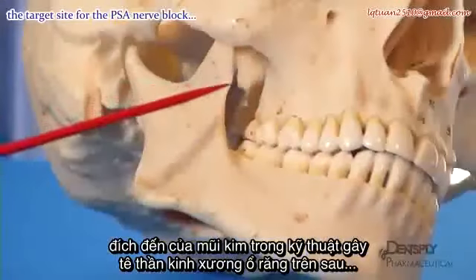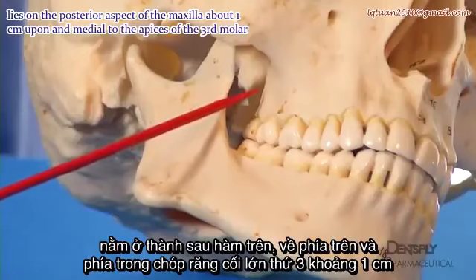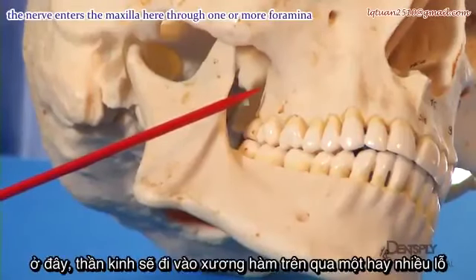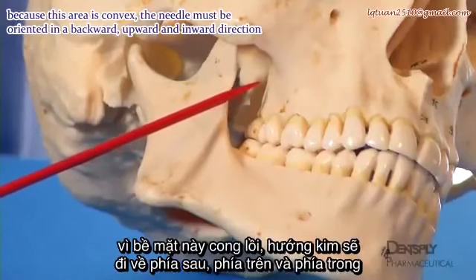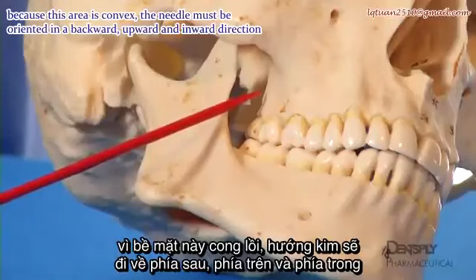The target site for the posterior superior alveolar nerve block lies on the posterior aspect of the maxilla, about 1 centimeter above and medial to the apices of the third molar. The nerve enters the maxilla here through 1 or more foramina. Because this area is convex, the needle must be oriented in a backward, upward, and inward direction.